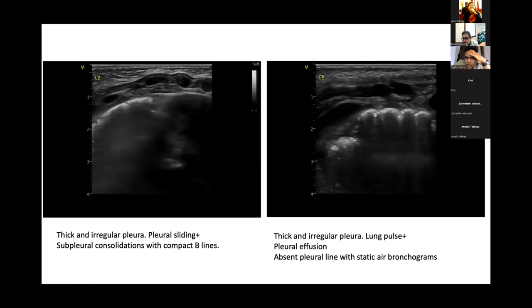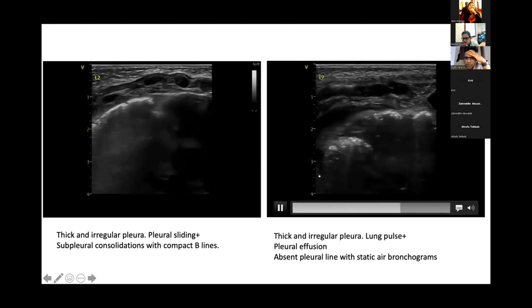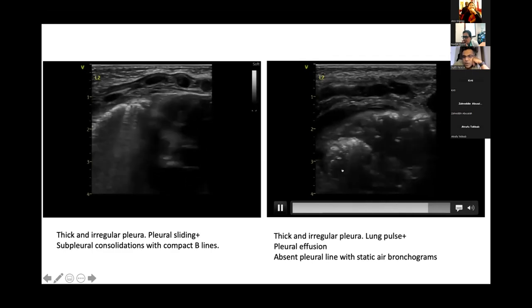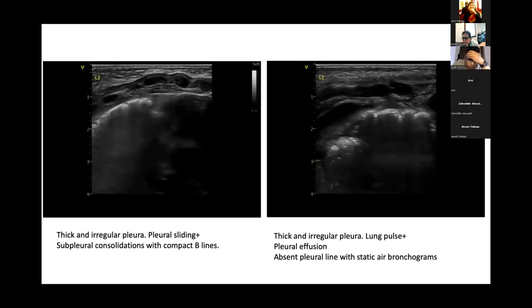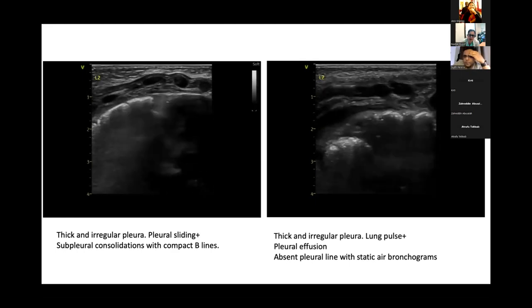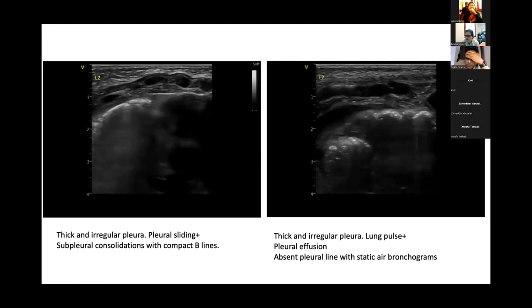I did put color on this, and it didn't light up. Right at the bottom there was a little bit of a vessel that I could see. But what you're seeing, this brightness here, there was no color going through. Not mirroring of the stomach, for example. No. My probe was just beside the heart, and it was sort of tilted, so it was away from it. That's really good, having picked that up. We don't usually manage to do that. And this corresponds to the area where you have the opacity on the chest x-ray then.